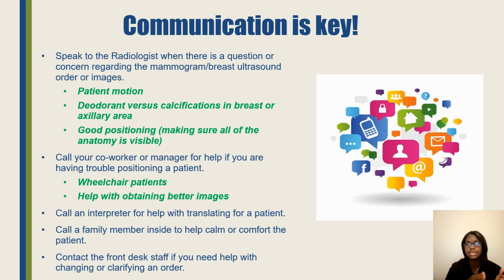So if AI flags that image, we also have notes saying why the patient moved, why we couldn't get correct positioning, or maybe an interpreter had to be called before we took the mammogram images, but we couldn't use an interpreter during the images, because if the phone is over there and the patient is over here, the patient probably can't hear the interpreter. So just communicate and put notes in, because if AI's results are matched up with your notes, it can all come together and make sense.